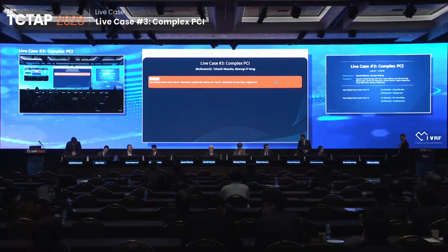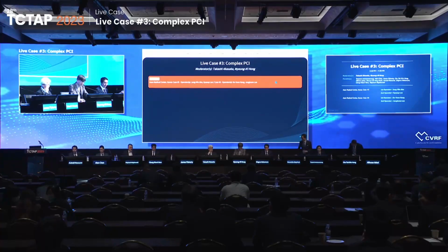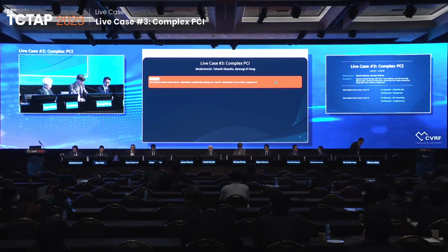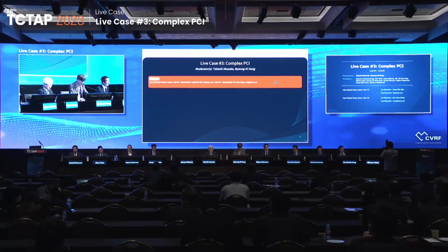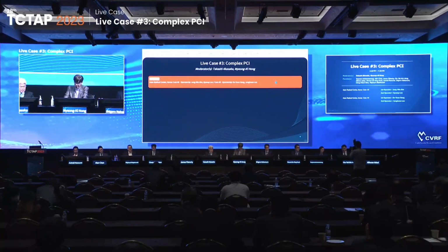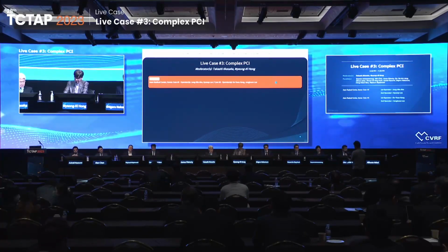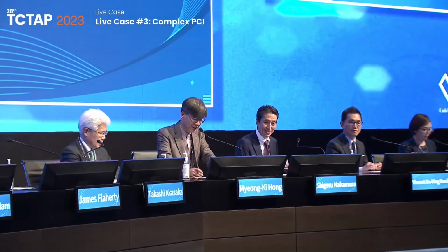I'd like to start this session on live case 3, complex PCI. I'm Dr. Hong. My co-moderator is Dr. Akasaka from Japan. We have several famous panelists, Dr. Aramsareewong, Dr. Chan, Dr. Flaherty, Dr. Hong, Dr. Takashi, Dr. Vincent, Dr. Masoumi, Dr. Nakamura, Dr. Nam, and Dr. Wojciech, sorry. And we have 2 live cases from the Asan Medical Center.